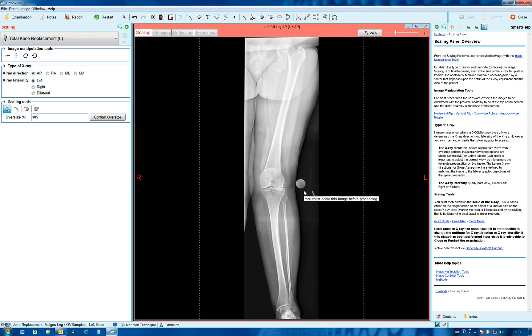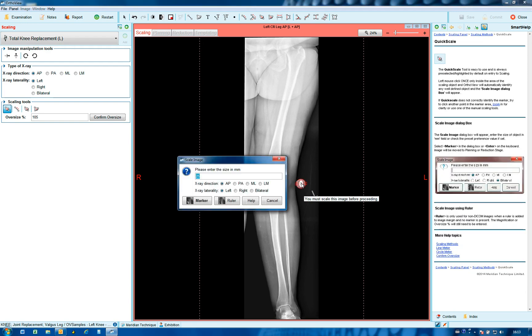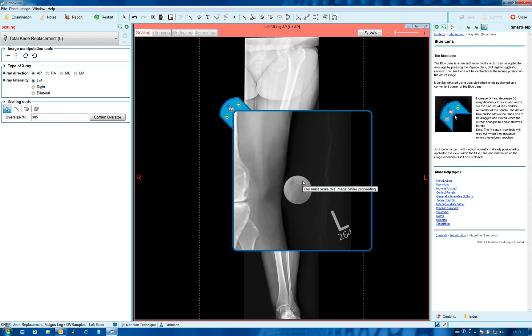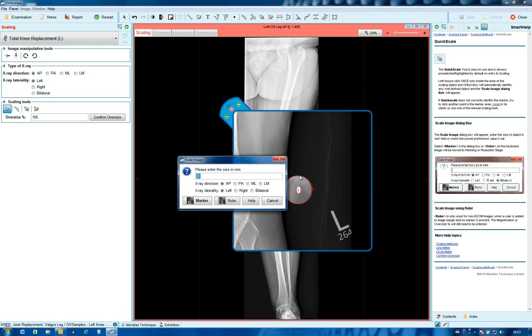In the scaling screen, for example, when clicking using the automatic marker, one needs to check that the actual mark has been correctly identified. If this is the case, sometimes it's beneficial to point the mouse over the marker, click the space bar to activate the blue lens, which is described here in detail, and then choose the item so one can see that it's correctly identified and say it's a marker.